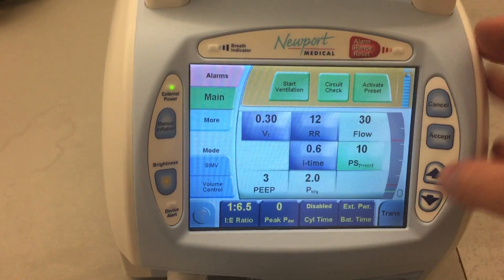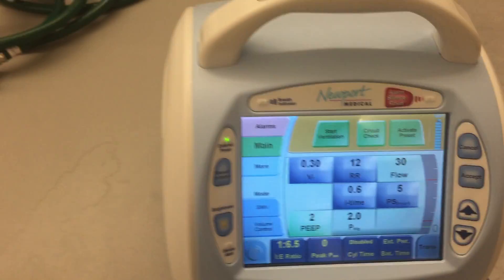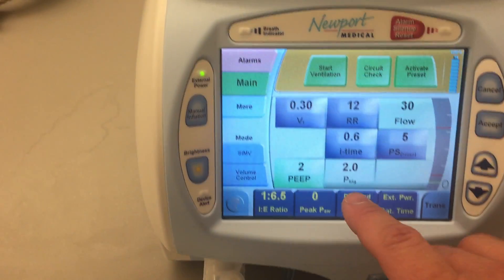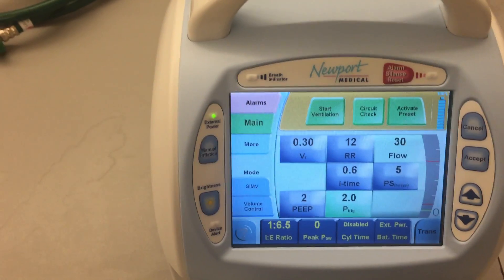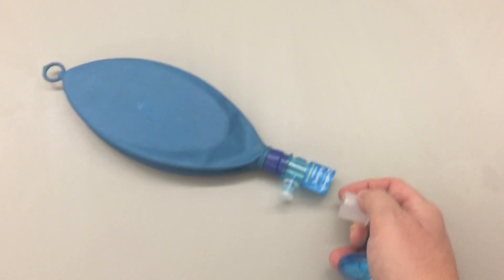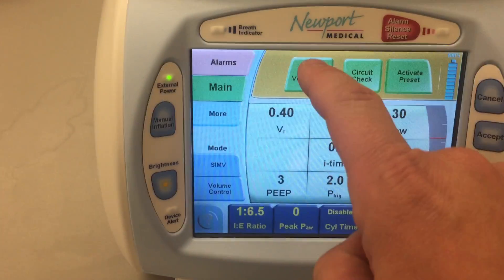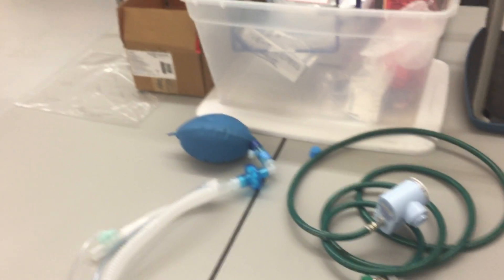And I want 5 of pressure support, and 2 of PEEP. And I want to trigger this based off of pressure at 2 centimeters of water pressure — and that's my trigger right there. So now that I've got my basic settings in, I'll go ahead and take the cap off of the circuit, and I will attach the circuit to the test lung. Then I'll hit Start Ventilation, and you can see that we've initiated ventilation.